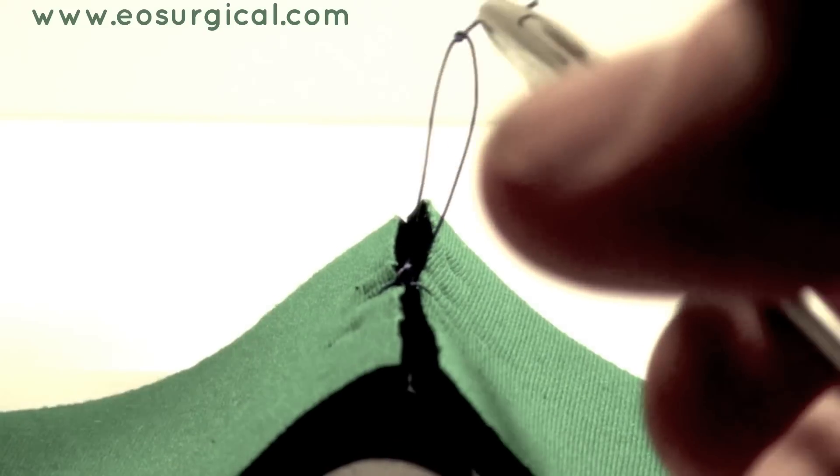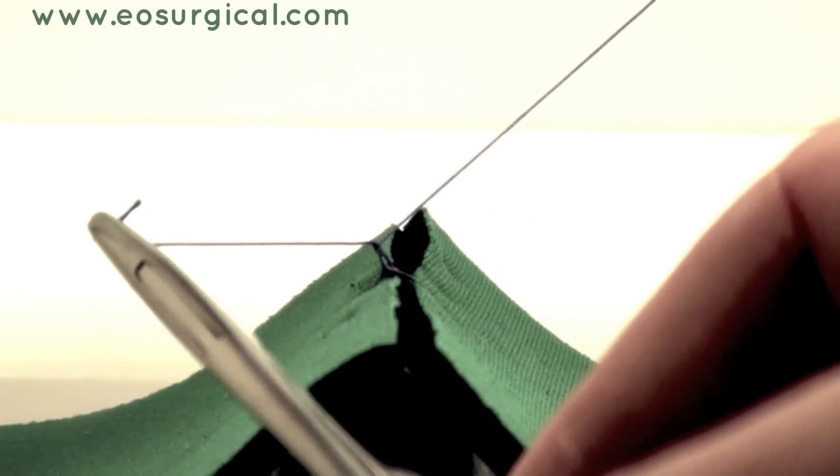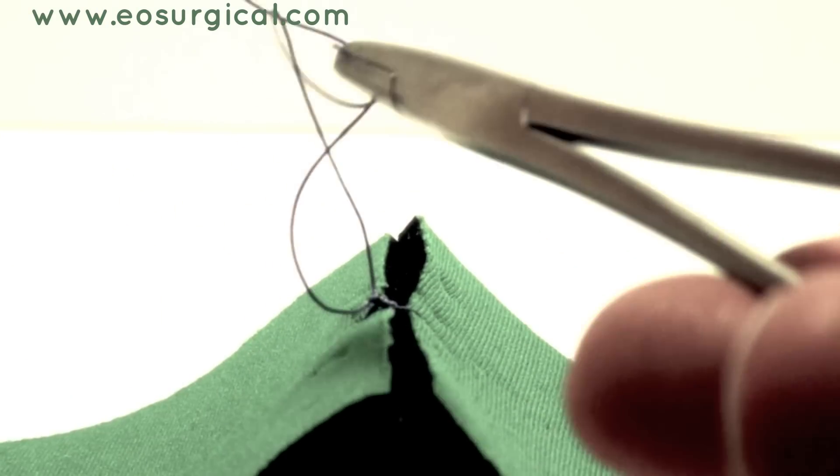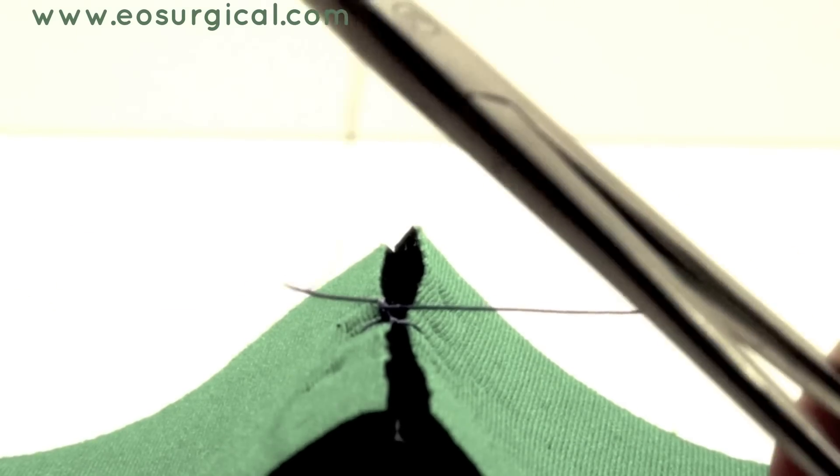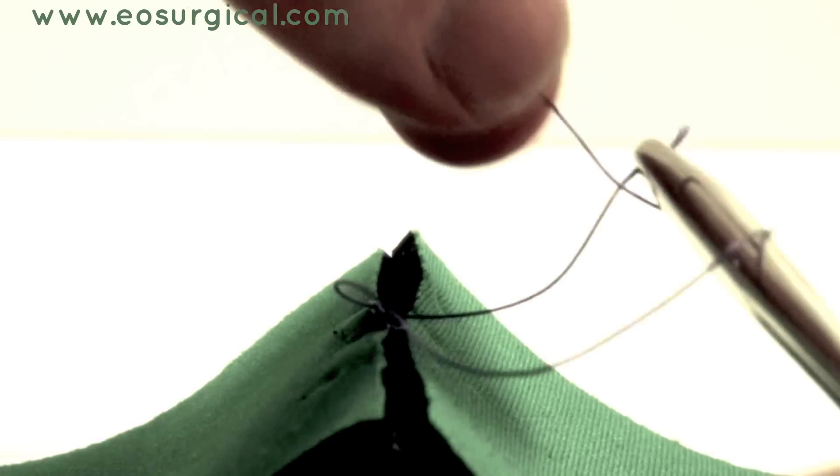The direction in which you cross your hands should reverse each time, and by doing this, you will throw square knots as shown here. Watch how the knot lies down flat as it is being tightened.